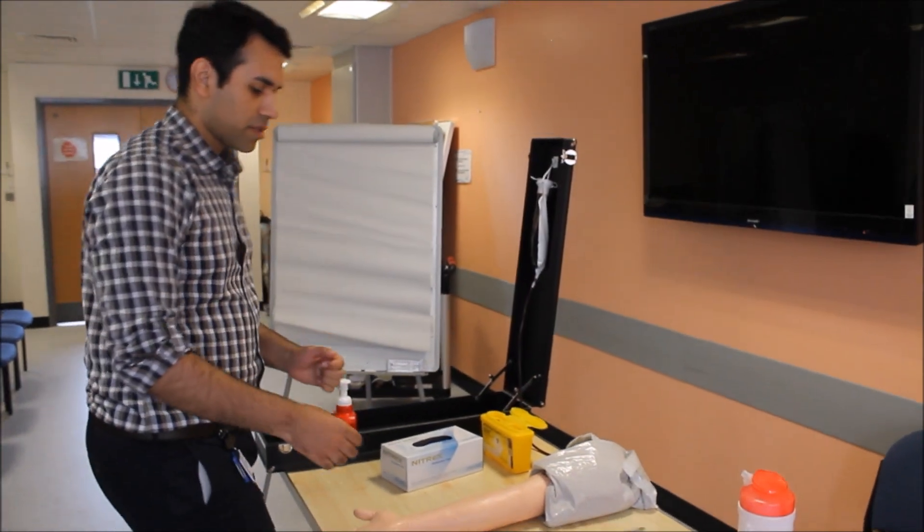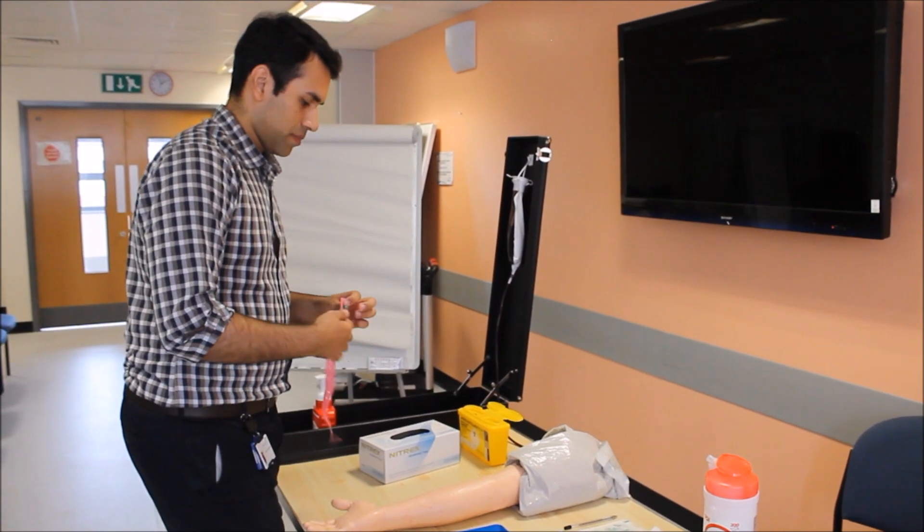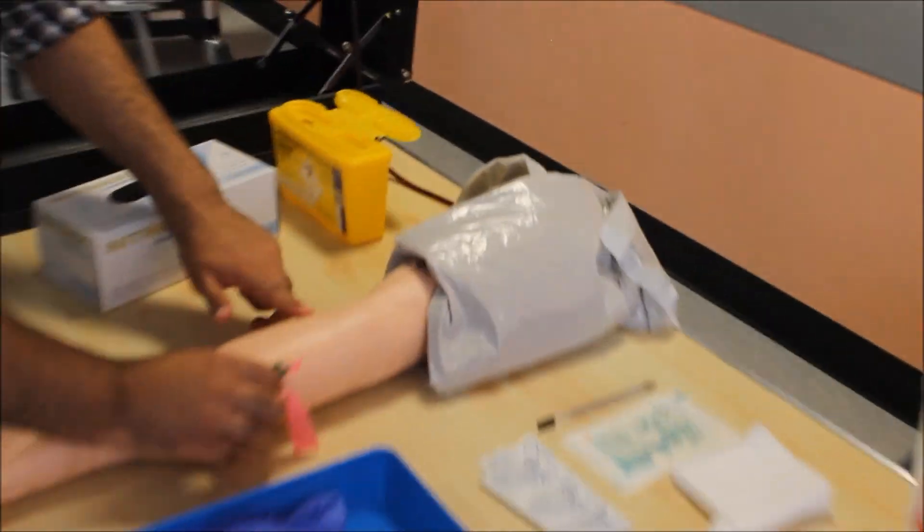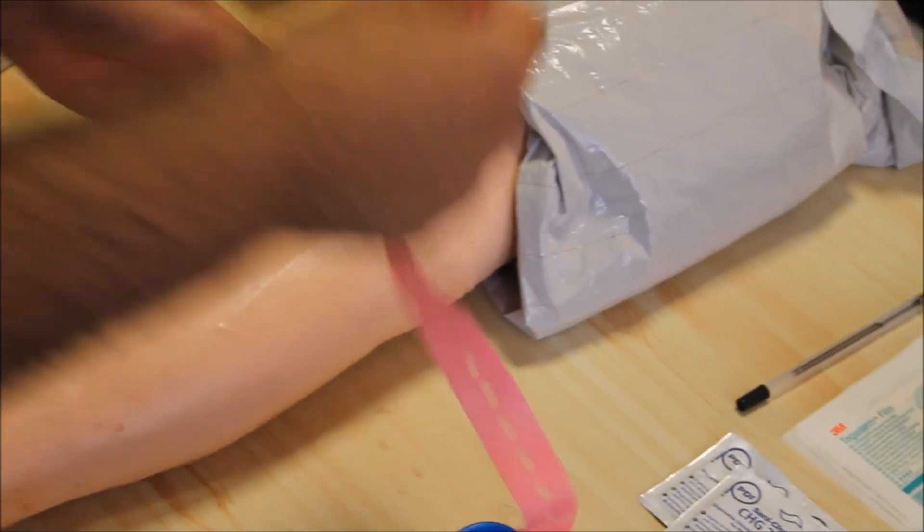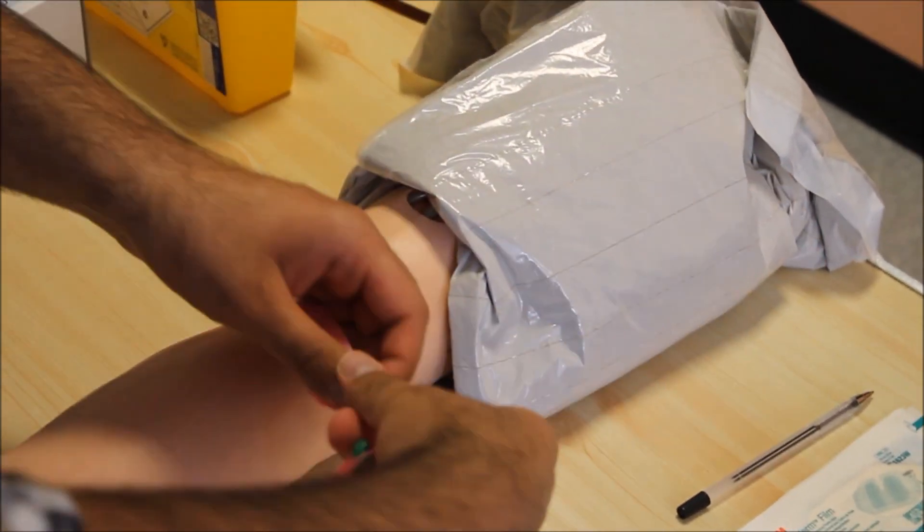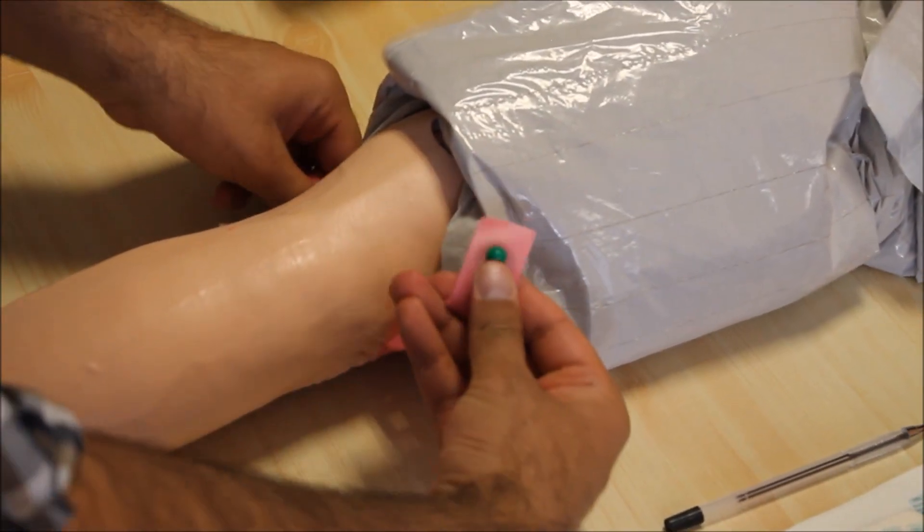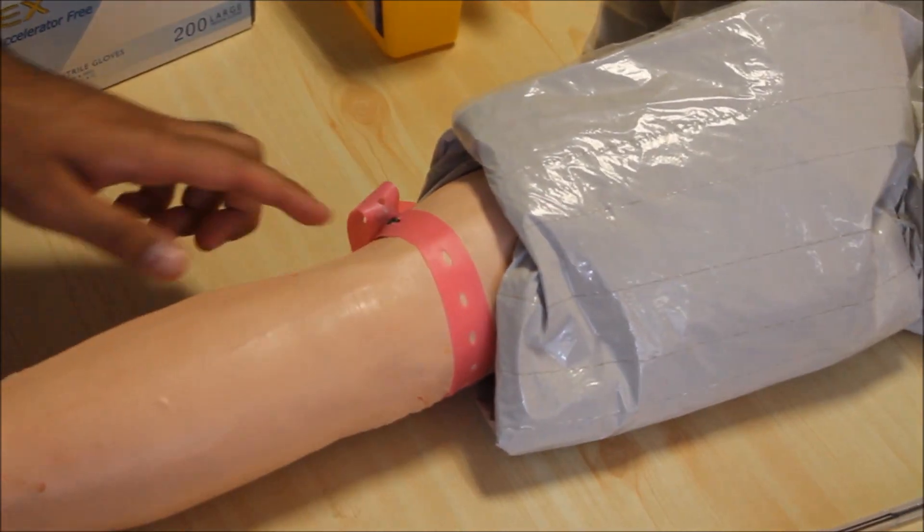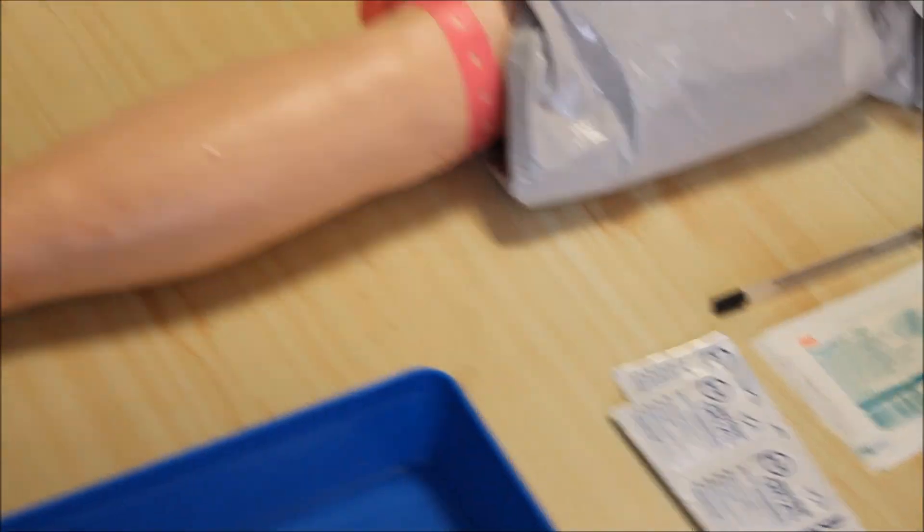After that, I'll go to the patient and see if he's got any good veins. Yes, he's got one here. I will put the tourniquet under the patient's arm and ask him to pump his hand for a bit for his veins to get a bit prominent.